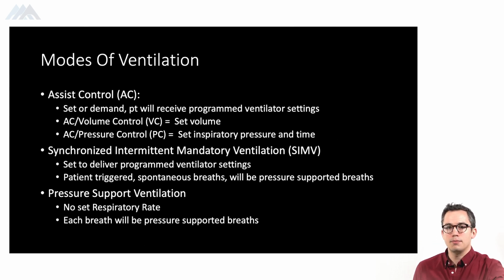And if they take a breath over the specific respiratory rate that you set the ventilator to, they're also going to be delivered that volume. In pressure control, you're going to set a pressure that's going to allow you to have an adequate tidal volume. And just like volume control, if they initiate that breath, then that is going to be a fully supported breath as well.